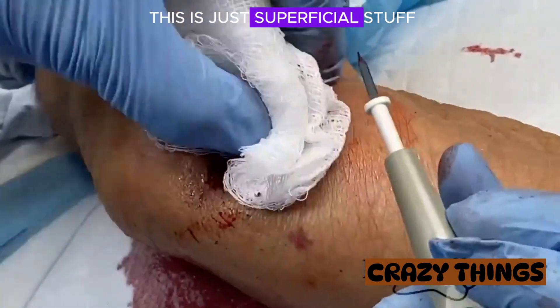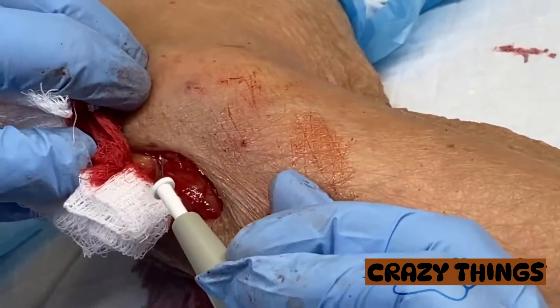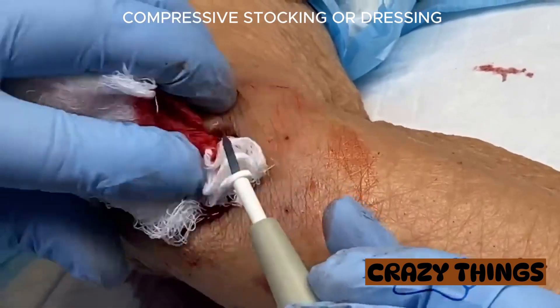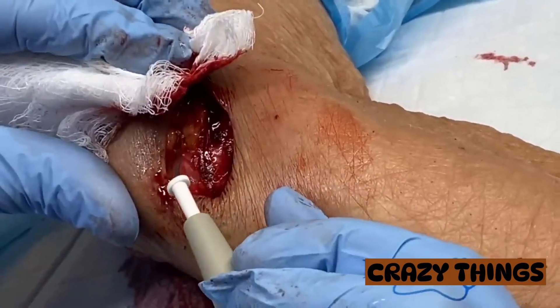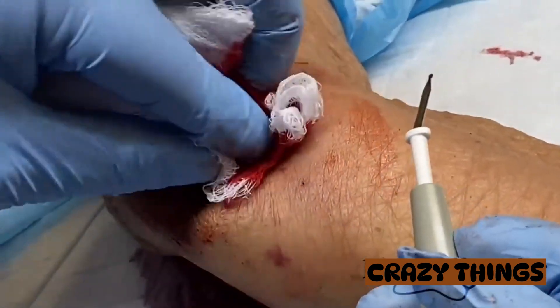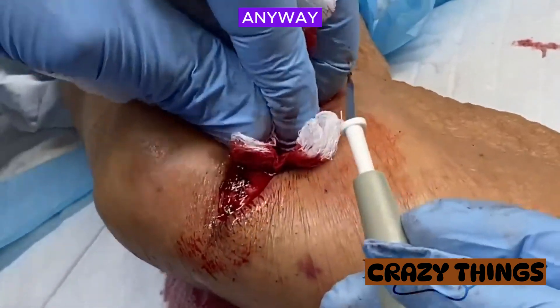So again, most of this is just superficial stuff. As I was saying before, I don't mind a little bit of oozing. The advantage we have here with something that's on your arm is we can put a compressive stocking or dressing — that should catch these and tamponade them for us anyway.